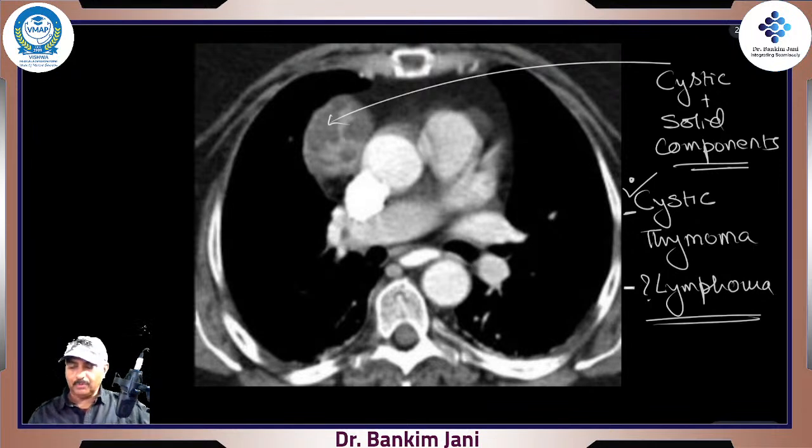Okay. How do you differentiate whether it is water filled or something else? Computers are at our help. CT, computerized tomography, is where you can put the cursor and measure the density, right? When we discuss the CT, we'll discuss at length what the water density is, what the blood density is, what the tissue density is.